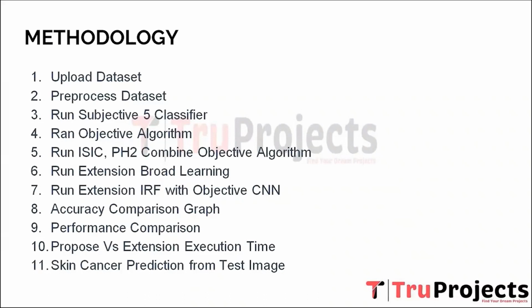Eighth, accuracy comparison graph. To evaluate the performance of the various algorithms and extensions, the system generates an accuracy comparison graph. This graph visually represents the accuracy achieved by each method, enabling a comparative analysis to identify the most effective approach. Ninth, performance comparison.